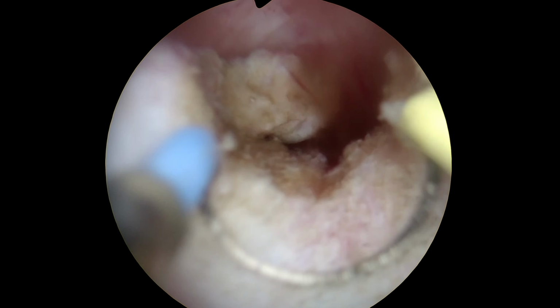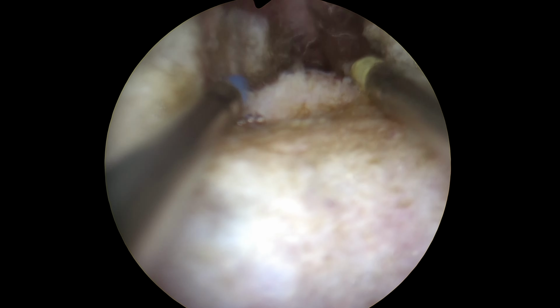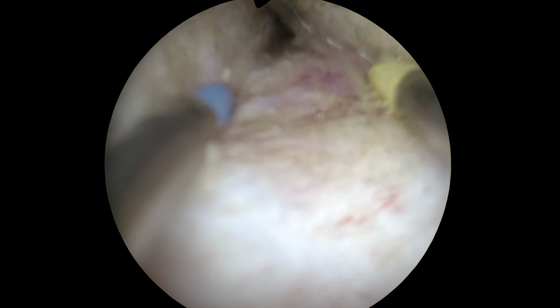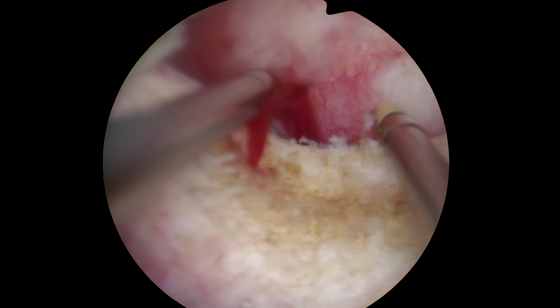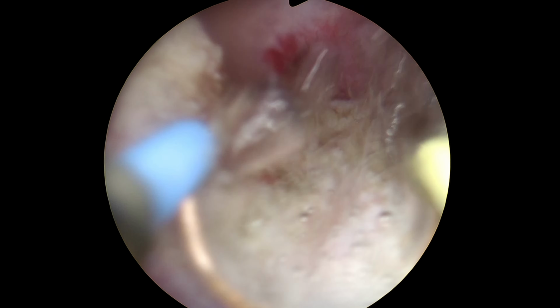As you can see, the size of the fibroid doesn't allow us to freely pass behind it and visually examine part of the uterine fundus, which would allow us to work much more safely. And my further actions are meant to open the space towards the uterine fundus and find the myoma's pedicle as quickly as possible.